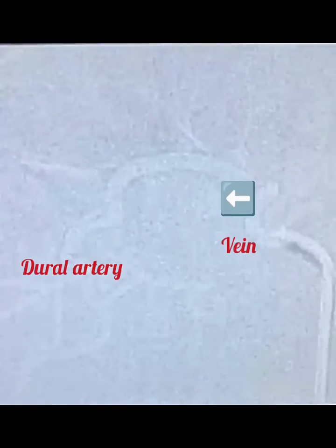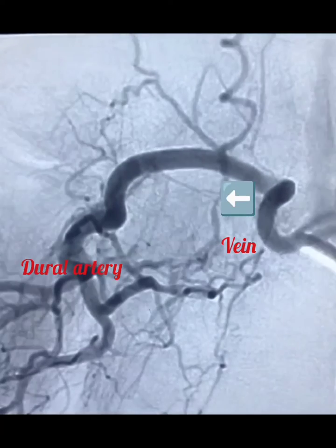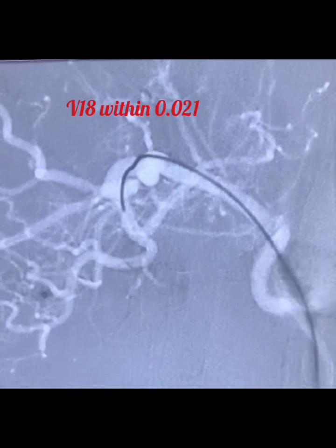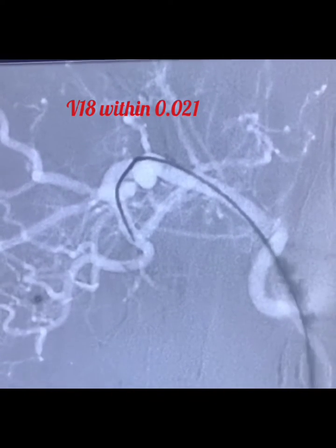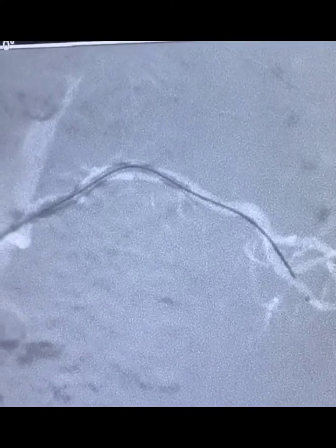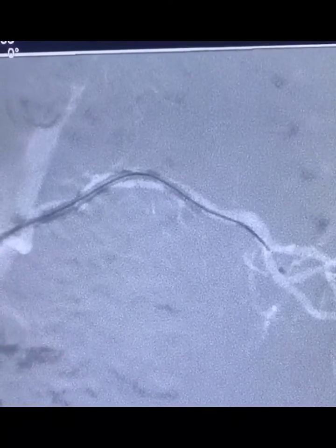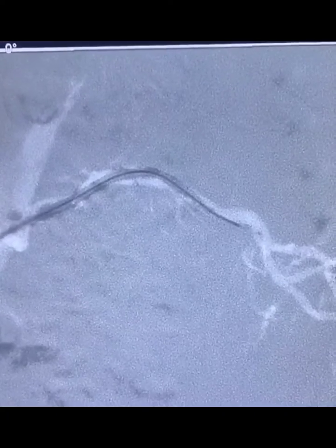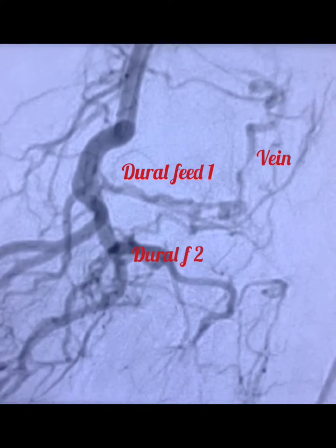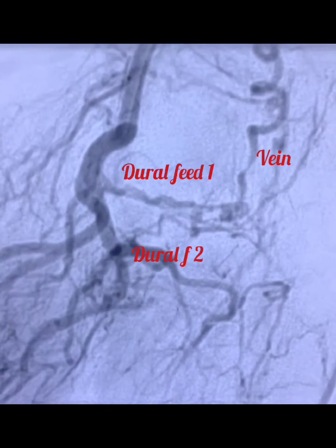Note a dural AVF arising from the dural artery of the right lumbar radicular artery. There was a tight curve at the origin of the radicular artery, and therefore a microcatheter, an O21, was taken distally, and within that a stiff wire, a V18, was placed to take the Cobra further into the radicular artery. A focused injection revealed that there were two dural branches that were supplying the fistula.